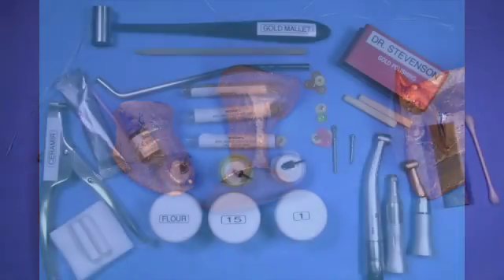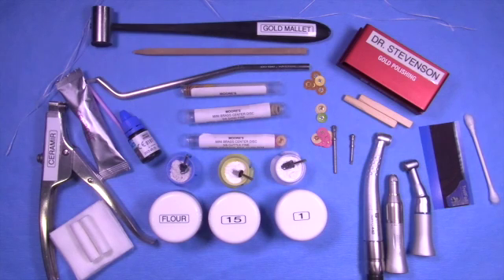So here are the castings—we have six. This is beautiful work done by Coi Habich. Here's the armamentaria we need for the procedure today. It looks complicated but actually it's pretty straightforward.